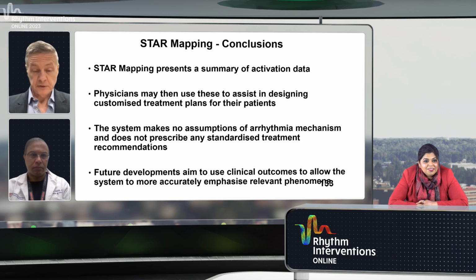Well, I'm glad that Atul's going to finish, because I'm a disciple of his studies, and I'm a great believer now that less is more. I think there's a sweet spot where you do enough to stop the AF, but if you do more, you're creating substrate and creating disease and making the situation worse. And I hope technologies like this will help us become much more focused and targeted.